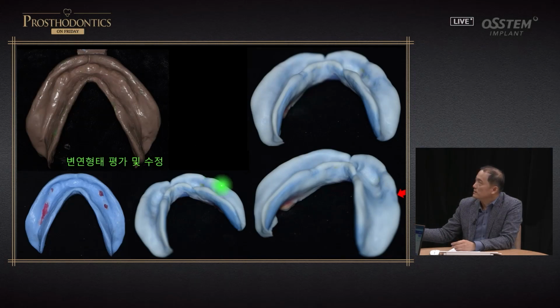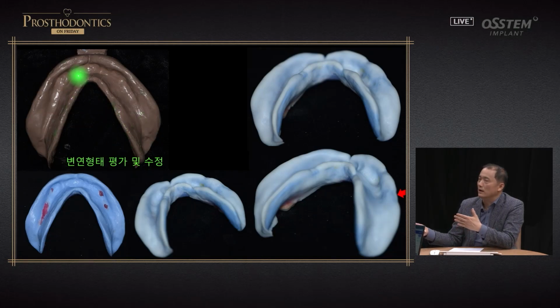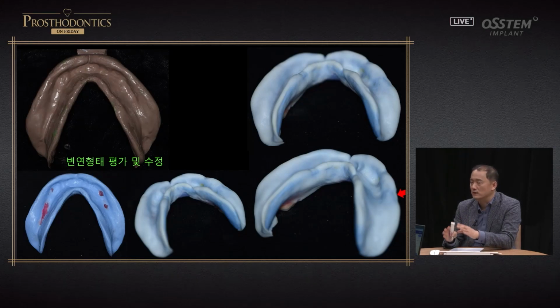These are the photos I had taken, and they show that even with border molding, for this patient case, on the labial side you have an extension, and the material is exposed. In other words, there is overloaded pressure, and so the border molding was not exact. Because of this, you have problems. With this type of border molding, you have to make an assessment and make modifications before you make the denture.